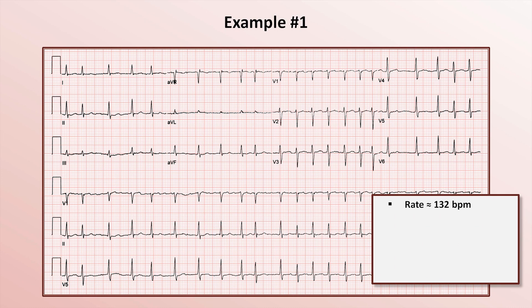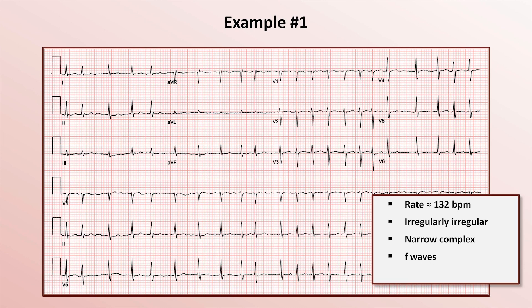What is the regularity? It is irregularly irregular. Are the QRS complexes narrow or wide? They are narrow. What is the atrial activity? There are no P-waves or flutter waves, just small amplitude undulations in the baseline — these are fibrillation waves, or F-waves with a lowercase f.